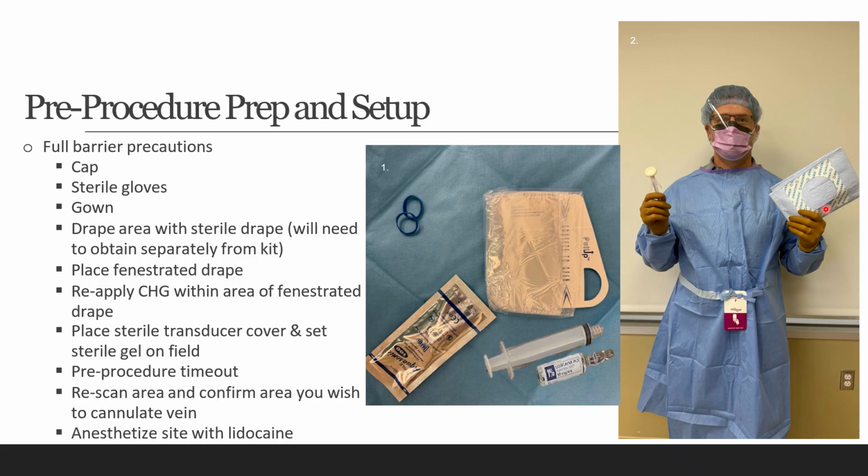And you want to do a timeout to make sure you have the right location. Rescan within that re-prepped area where you put your fenestrated drape just to make sure that the vein you intend to cannulate is still in that location. And then you want to grab your lidocaine and numb the site where you plan to stick them.